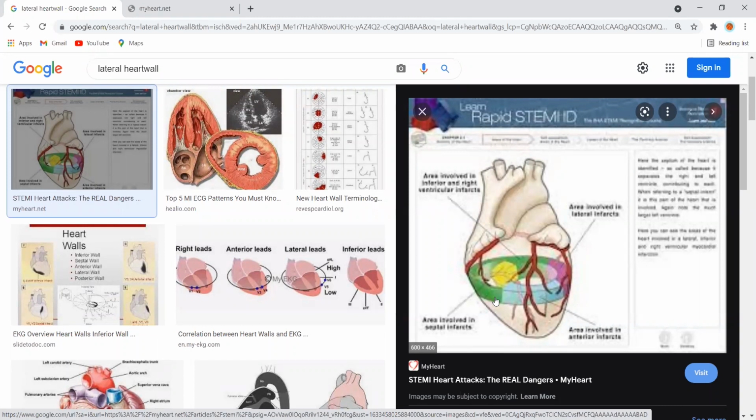Left ventricular tachycardia. In left ventricular tachycardia, which axis deviation will occur? Dr. Musarat, left ventricular tachycardia is the cause of which axis deviation?